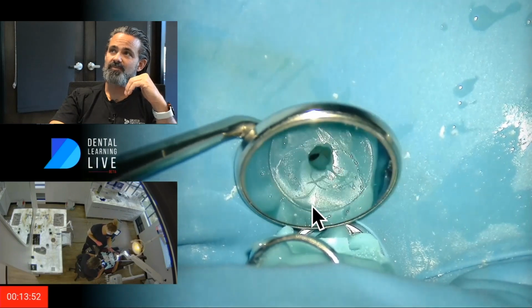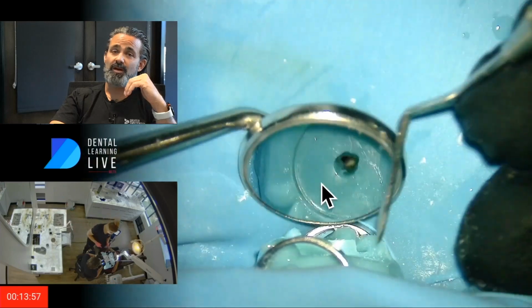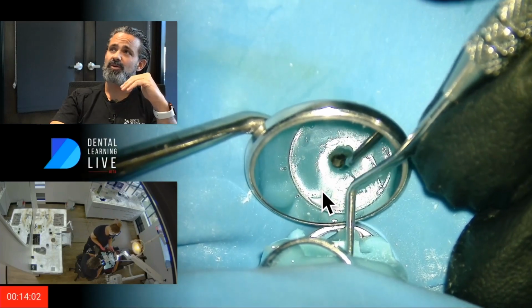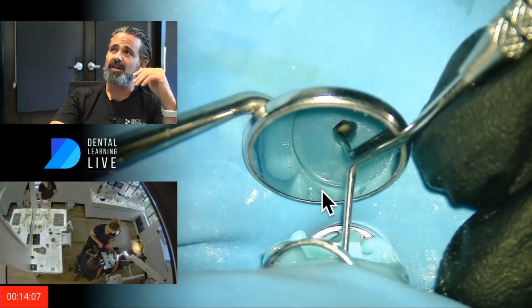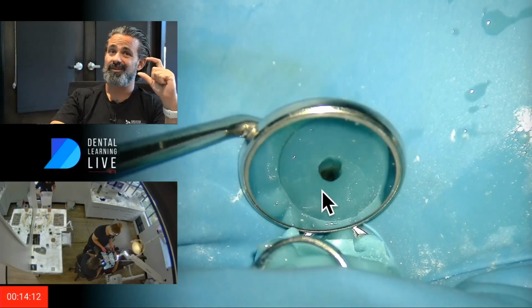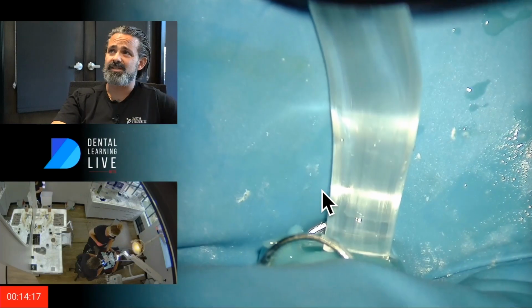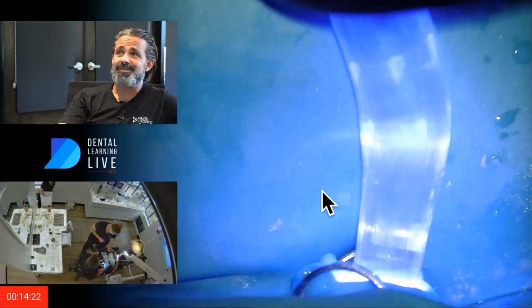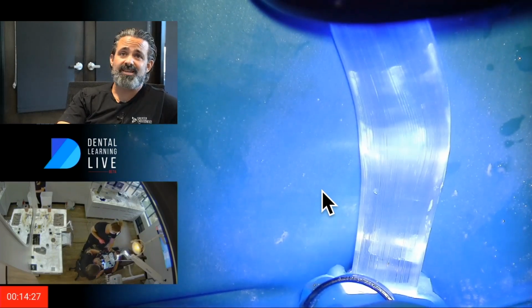And again, it was kind of part of where that little gap was up kind of coronally. So I just felt like I wanted to close that off. And again, I know there's sound still beyond that little bubble, but I like the flow. I like a nice exhaust pathway, and so that's what I do. And I'm stovetopping it, so I've really lifted the depth up there. But it's not hard. I mean, it's super easy to do, and we work under microscopes. You know, patching a perf repair is way harder than this. So there we go. We give that a last cure, and now I've set that up.